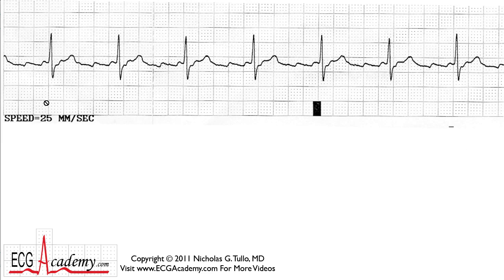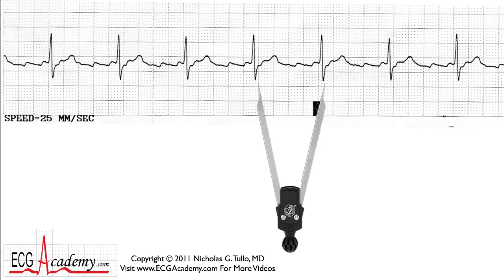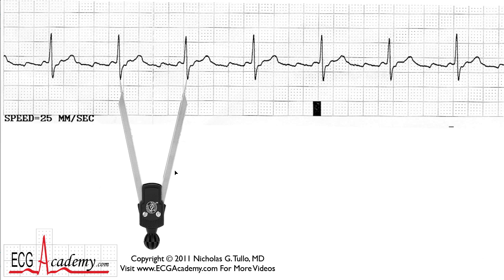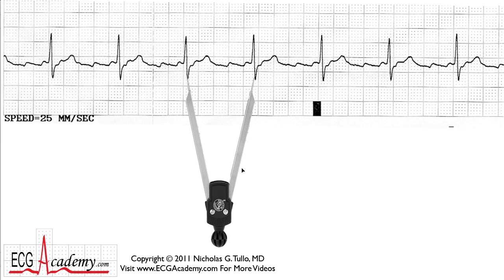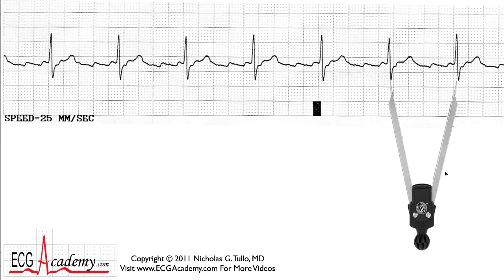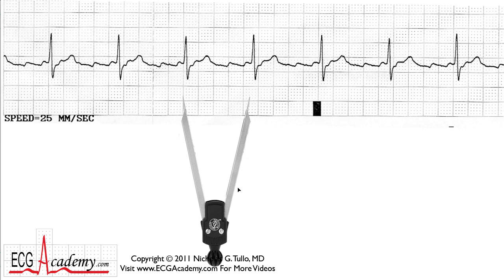Let's look at the forest first. You see the QRSs kind of marching through and they look pretty regular. Let's grab our calipers and take a look to see whether they are indeed regular. Put them down — I happen to have them at the right rate — and the QRSs certainly do appear to be very regular. What's the rate? If we count heavy boxes: 300, 150, 100, 75, 60 — it's between 60 and 75 beats per minute, so we'll call it 68.